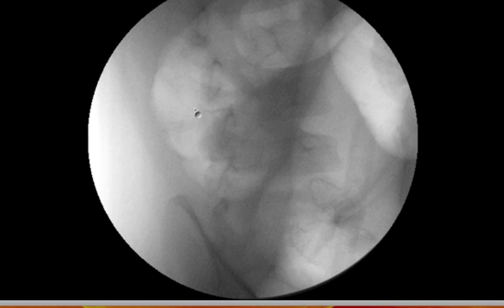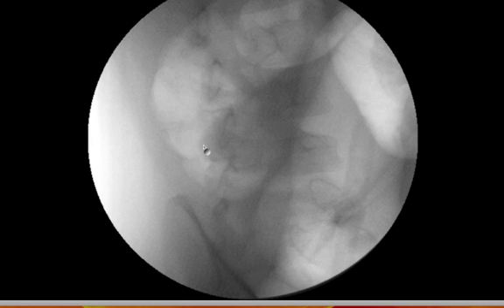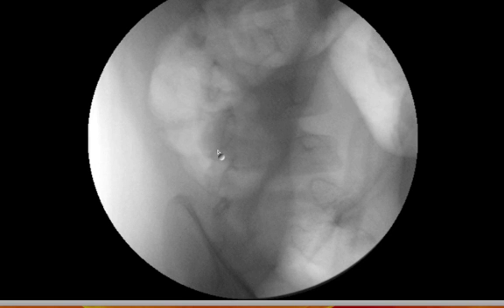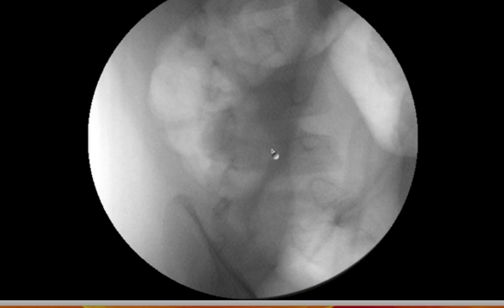I'm pushing in air, holding it for a while, then releasing it after a couple of minutes, and hoping that this will reverse and pop out into its normal native position as small bowel. Remember what you're looking at here is the cecum, and this is the bulging, protruding, telescoping distal small bowel protruding into the cecal lumen. It's very important when doing fluoroscopy — particularly with children and infants — that you know how to use image capture. If you have a brief moment of fluoroscopy and the image is on screen, you can save that monitor image rather than taking a new fluoroscopic X-ray exposure. It's not as high resolution, but it's adequate for procedural purposes like this.